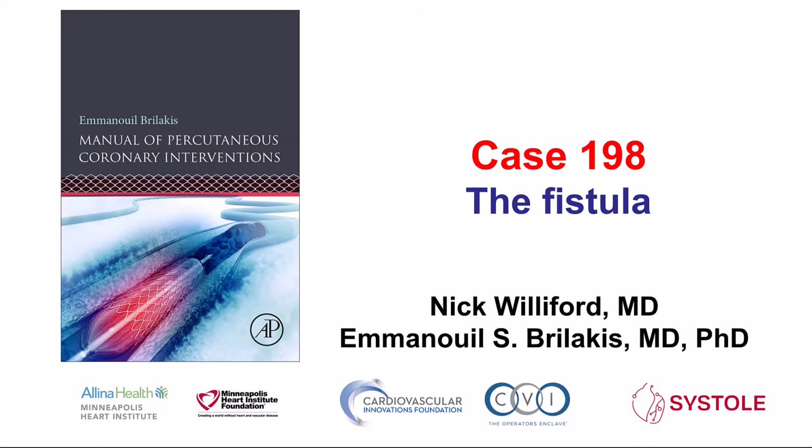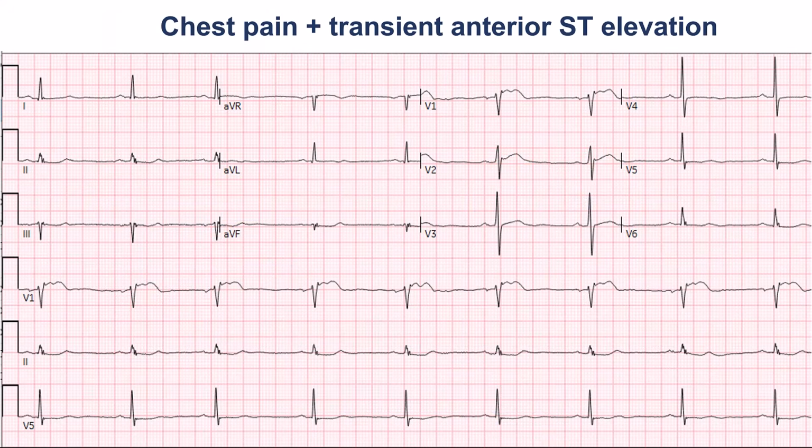This is a case of a fairly uncommon coronary finding, which is a coronary fistula. The patient presented with chest discomfort and transient ST segment elevation on the EKG. When he came to our hospital, there were minimal ST changes in the precordial leads.